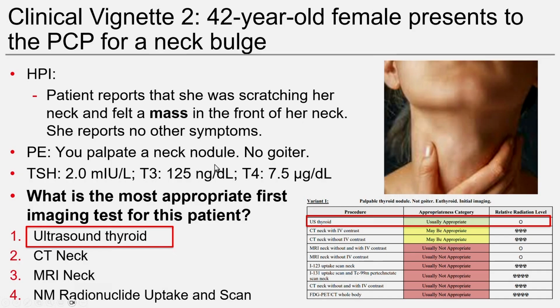Where would I find this information? You would find it on the ACR website. The American College of Radiology has very specific indications for what clinical query you should use, what modality. I mean, I know we have CT, MRI, PET scan, nuclear medicine, ultrasound, all these modalities, but the acr.org website allows you to give this ACR appropriateness criteria, and it actually says here for palpable neck mass, ultrasound of the thyroid, zero radiation, it's the way to go, usually, most of the time.